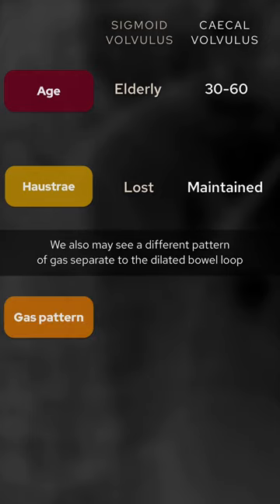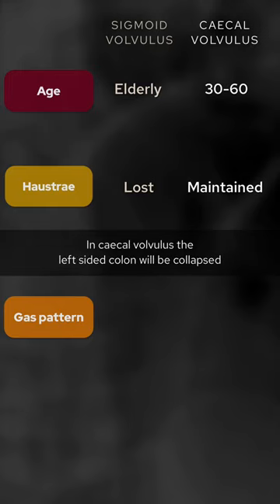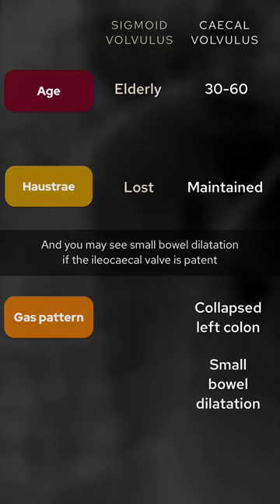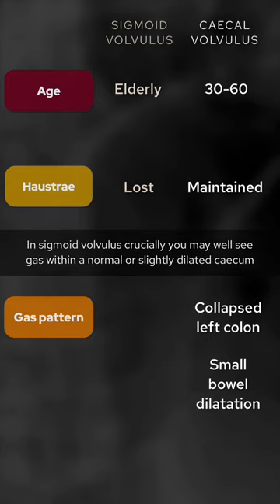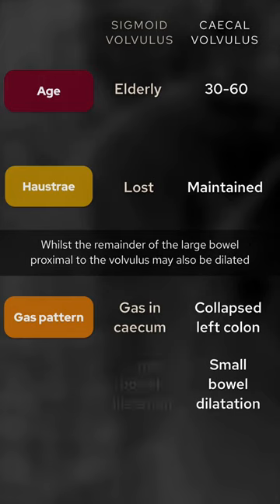We may also see a different pattern of gas separate to the dilated bowel loop. In cecal volvulus the left-sided colon will be collapsed, and you may see small bowel dilatation if the ileocecal valve is patent. In sigmoid volvulus, crucially, you may well see gas within a normal or slightly dilated cecum, whilst the remainder of the large bowel proximal to the volvulus may also be dilated.